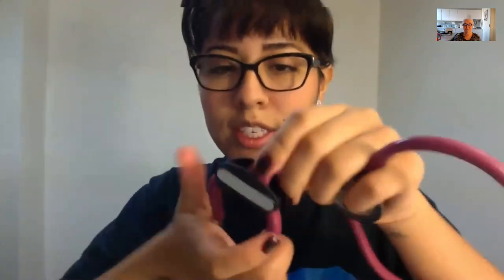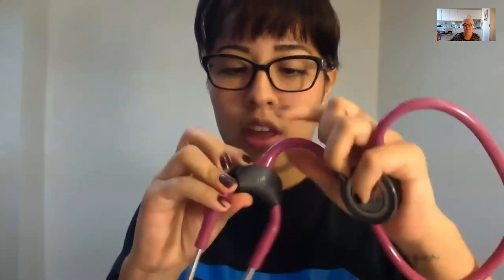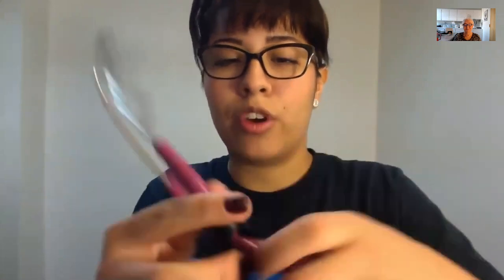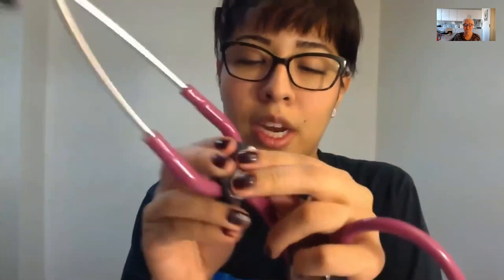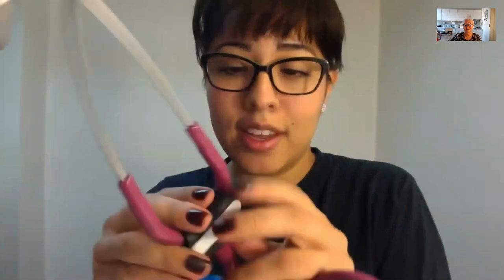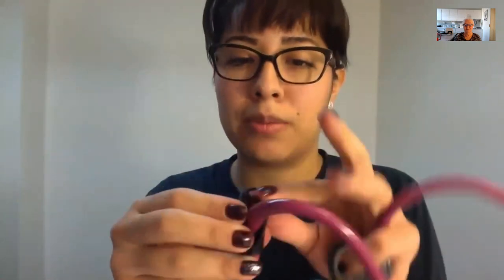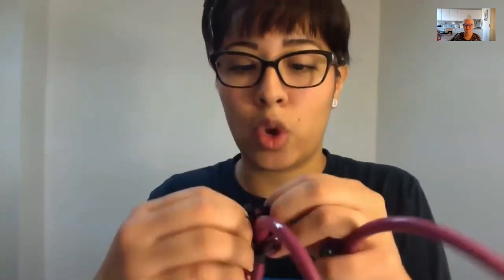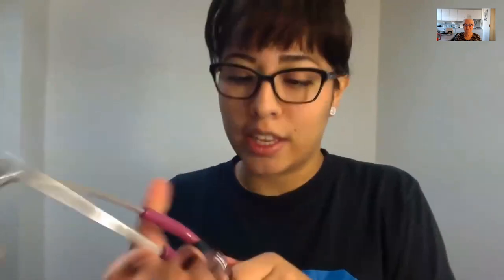Oh, and don't forget to clean behind this piece that you have here. That's why I'm pretty dirty, because I always want to clean under here. One negative thing about this is that once you put it in, I don't think you can take it out unless you break it. So cleaning under this area can be a little bit hard, because once these pieces are in, there's no way out unless you rip it. So that can be a challenge.